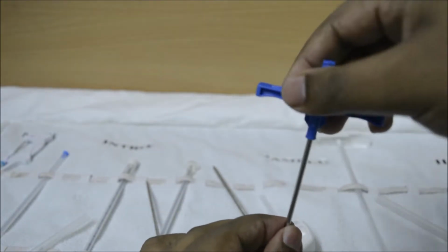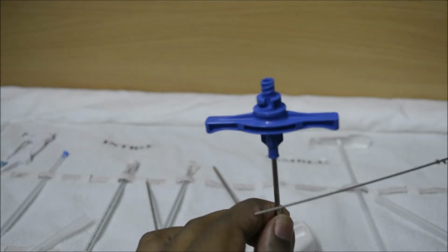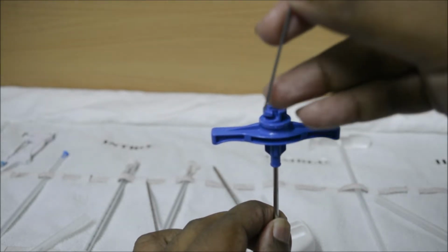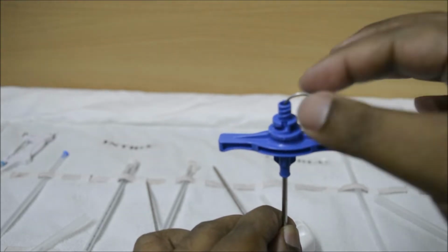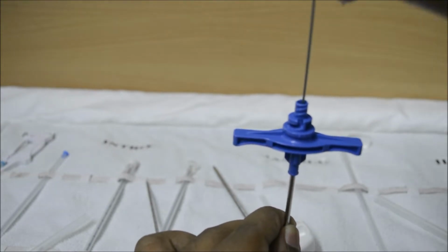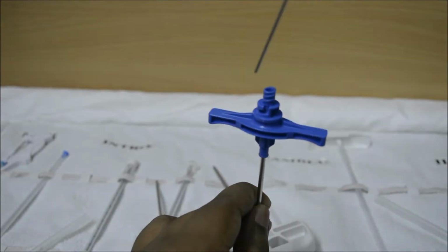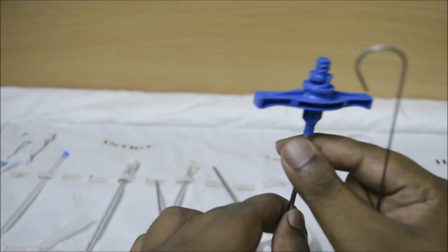Now after trephining is done, we need to check whether the amount of specimen we need is collected or not. This is called the sample collecting needle, or the specimen collector. It is inserted from the top, and using free fall it is just pushed inside, not hard, just free fall. For example, it gets stuck over here. If it gets stuck, we can understand that the specimen is already present inside the needle. For that reason it is not going inside completely. So we have confirmed that the specimen is available inside the cannula.